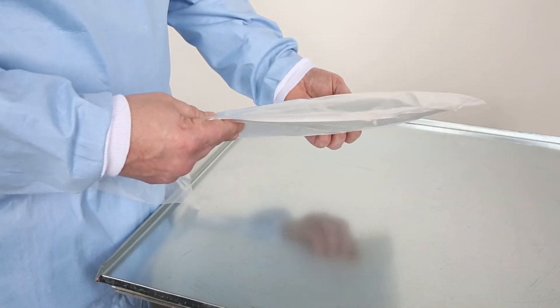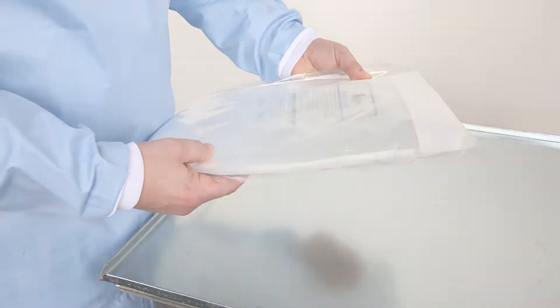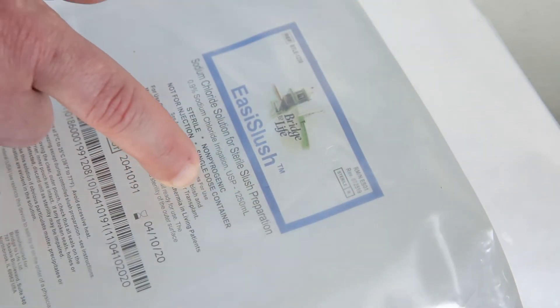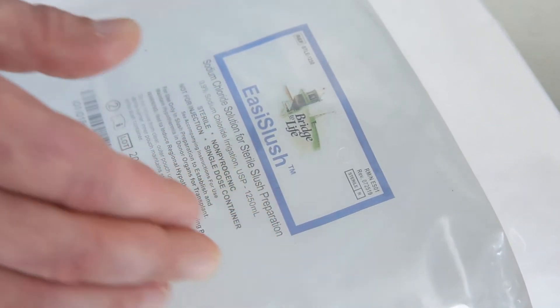After removing the Easy Slush Bag from the freezer, allow the product to warm until free liquid can be seen on the surface of the frozen solution. Free liquid indicates that the product is at the melting temperature and that manipulation will result in a slushed solution.